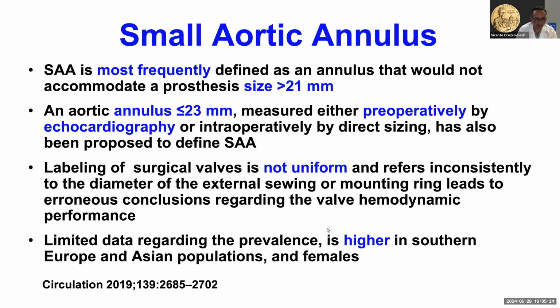Another thing that we learned, and we knew from the past but now know more, is that the labeling of the surgical valve is not uniform across all the vendors. This reinforces our understanding and our curiosity to always check what valve we're going to use and whether it would match the effective orifice area of these patients.